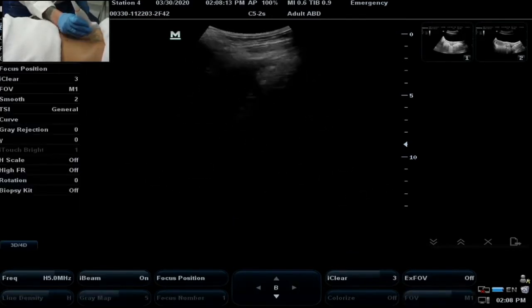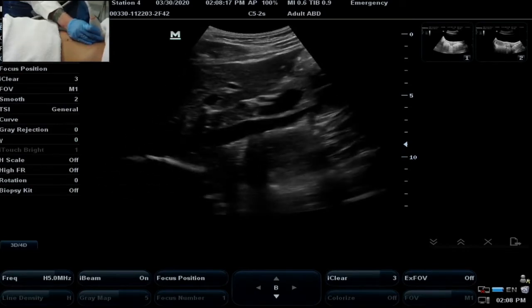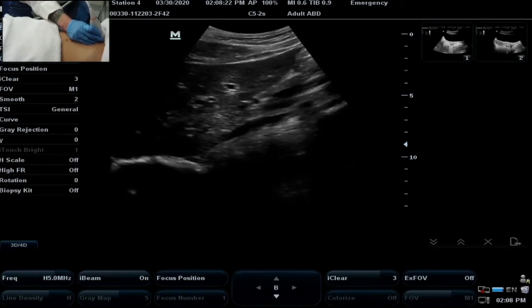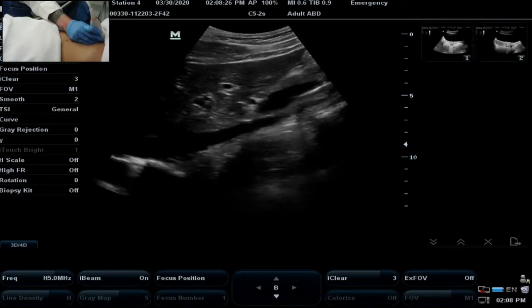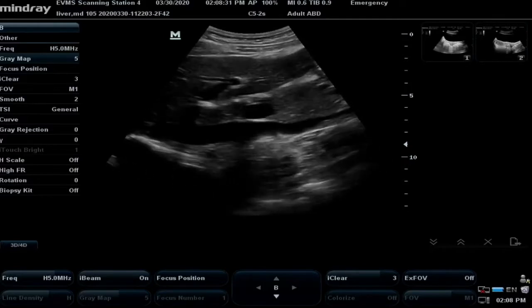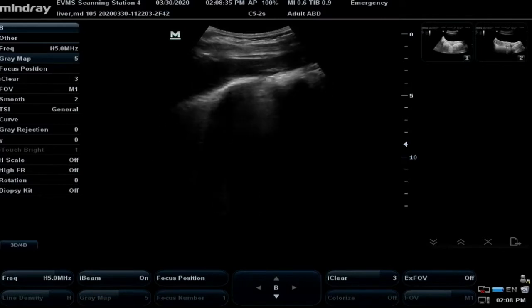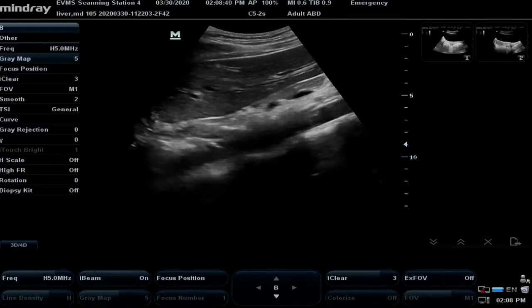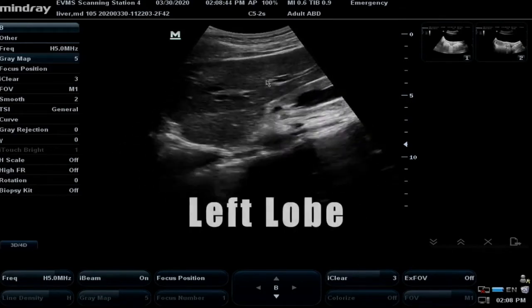So when I begin and just put the transducer on the abdomen, I am very high on the abdomen, just subxiphoid. And will you please take in a breath and hold it? And you can see just that breath in really increases the view of liver anatomy we can see. So when I'm here in midline, at midline of the body, I'm looking at the left lobe.